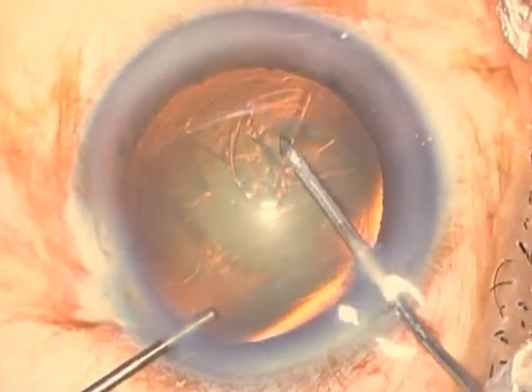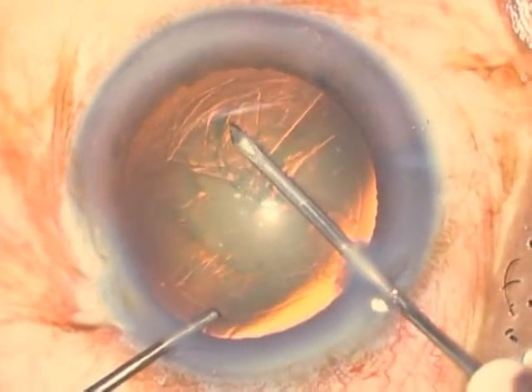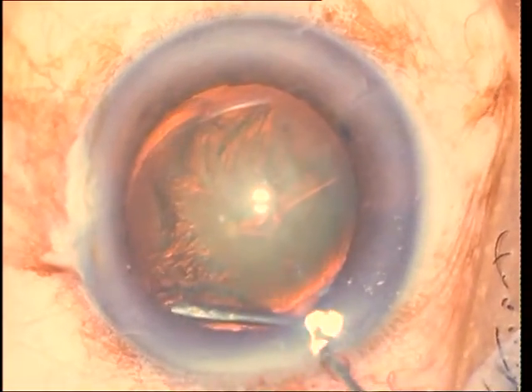You do need to have an adequately sized rhexis in order to be able to chop well, especially for a horizontal chop where you would need to take the chopper under the rhexis rim. Now once the rhexis is completed, what I'm doing next is performing a good hydrodissection.